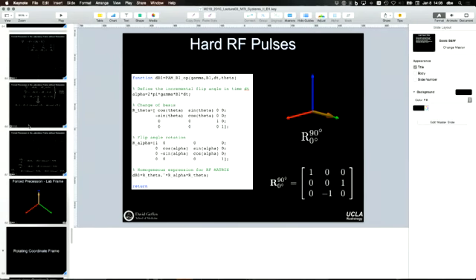Say that again? I'm a little confused as to where you put your left thumb. Like for an arbitrary angle, say it wasn't 0 degrees at the bottom. Yeah, 15. So would your thumb be 15 degrees from X towards Y? Yeah, and so 90 gets you all the way to Y. Right? You could do 45 and be halfway in between. Whatever, it's based on how far that determines.